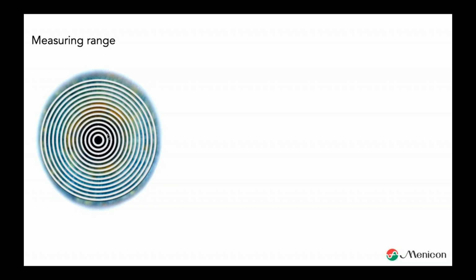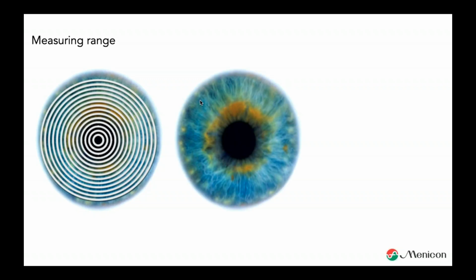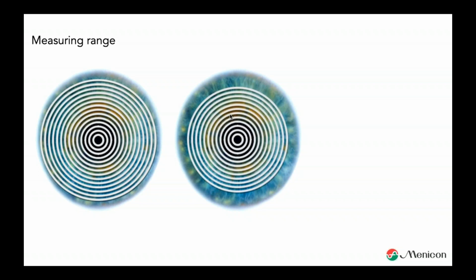there are a couple of topographers, mostly Scheimpflug cameras, I have to say, but two or three topographers. The majority of topographers measure a bit less, and that isn't a problem. We can extrapolate the data out. We have had topographers in the Netherlands for around 20 years, and we already have 20 years of experience with the calculation. So we can do a good calculation for the missing rings. If you have a topographer like this, it's not a problem at all.